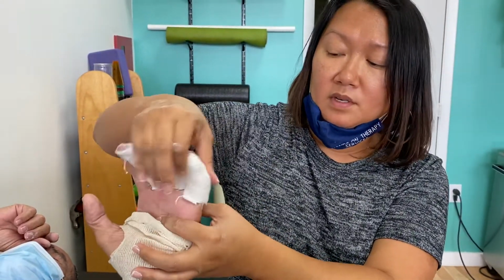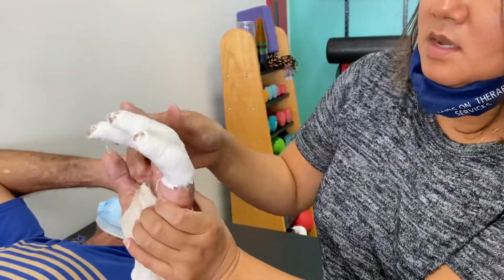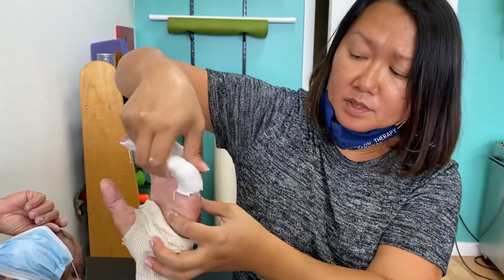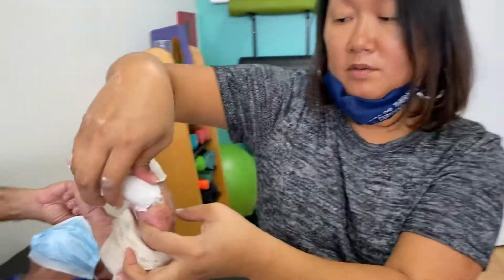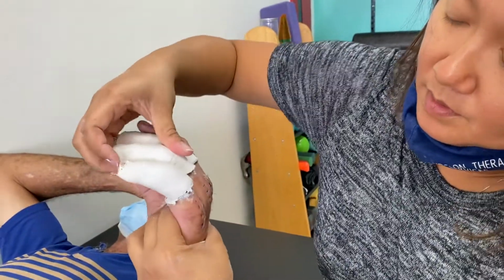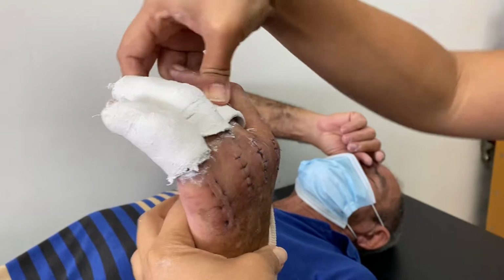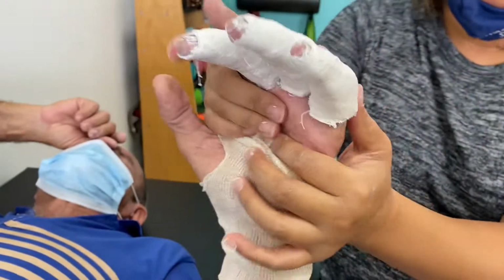And what I've done is I've done it so that we can really focus on the MP capsulectomies, right? I didn't do this finger because it's fine. Well, when I casted him, his MPs are really stiff, so that's the beginning part of the video that you see. So look at how loose it is a little bit now, right? So we're gonna show right here, right? So it's much better MP flexion, so about 60 or 70 right there, and then lower.